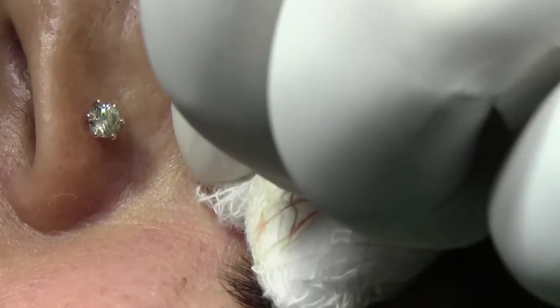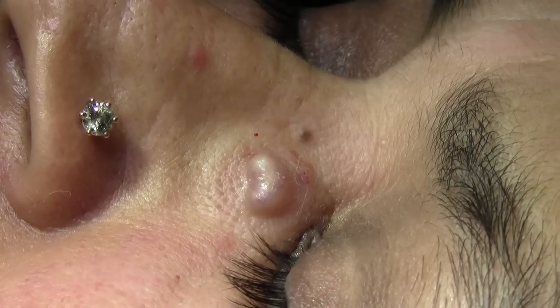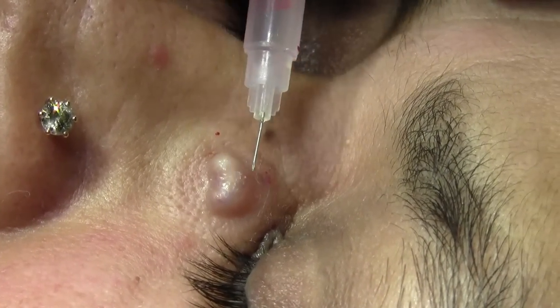This is basically a hydro-dissection. Now it is all ballooned up.